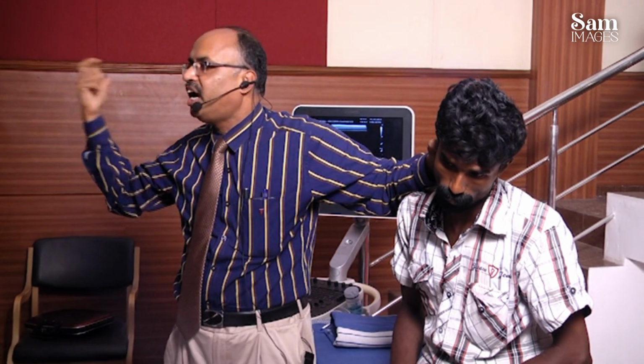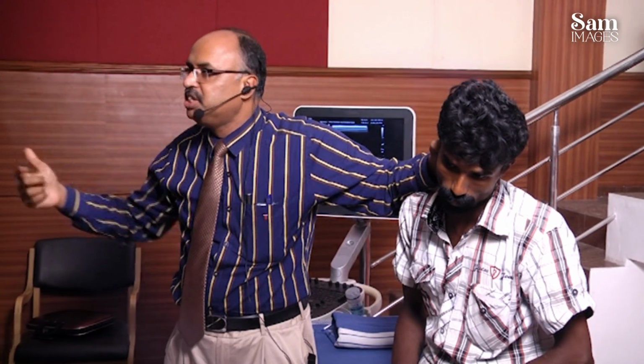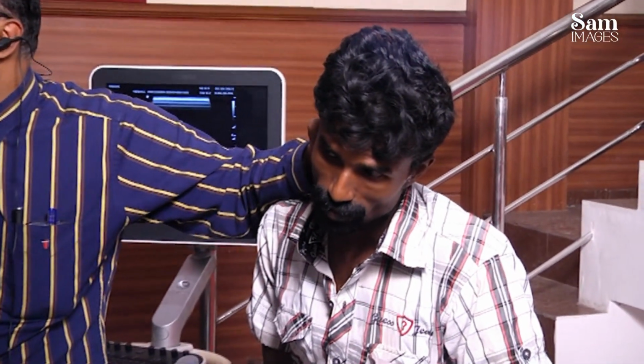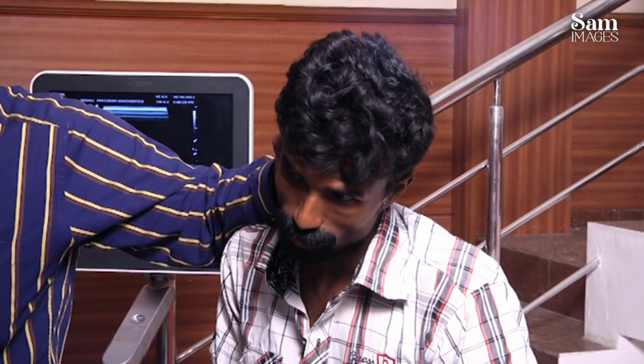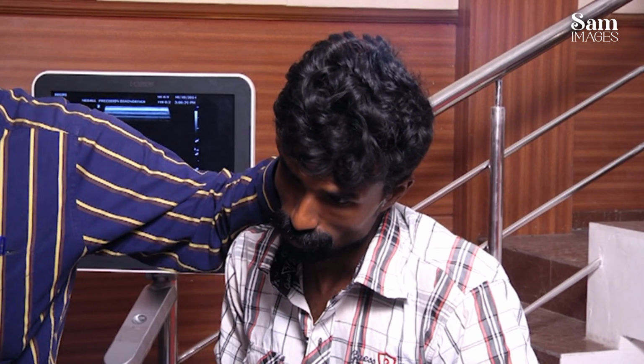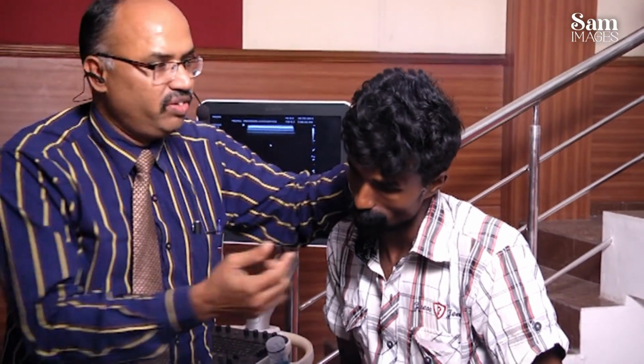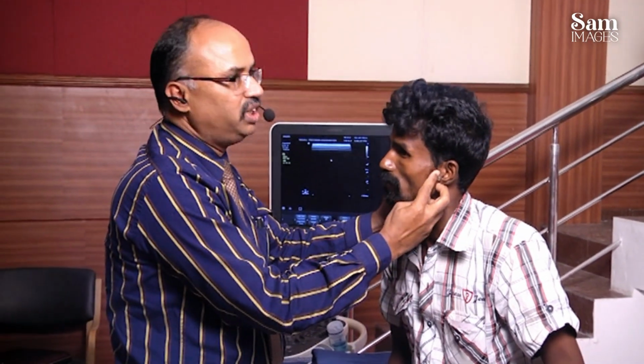You can also keep your hand on the temporomandibular joint. Please do that. Can you feel that? See, it is moving. That is the temporomandibular joint. That is the palpation. Similarly, this is the single side I have kept. Now I am keeping it on both sides. I am asking him to open and close it. Close, open.